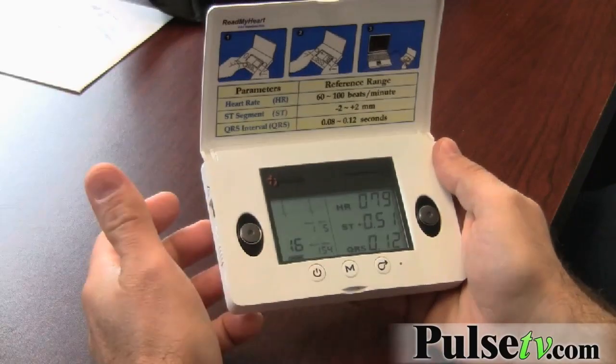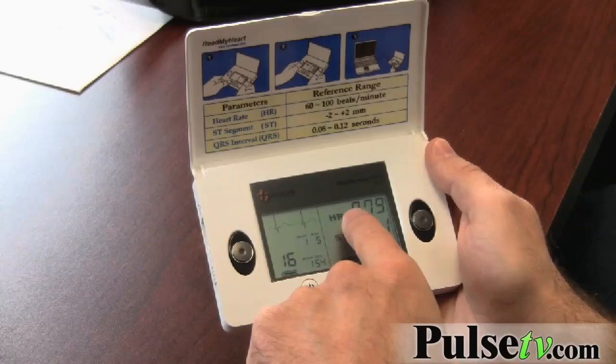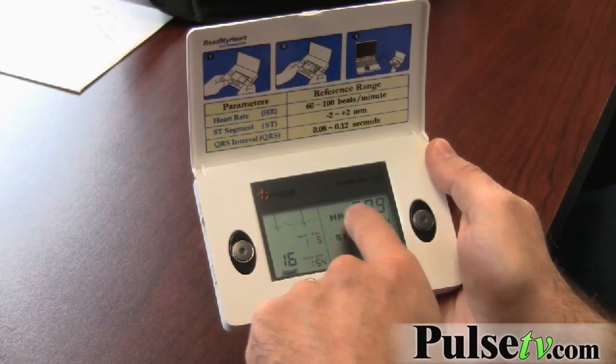The other thing you can do is hook this up to your computer and you'll get more information, and it'll keep track of your health. Sometimes if your thumbs are dirty or your hands are sweating you might get an error message — it'll say 'noise' right up here.